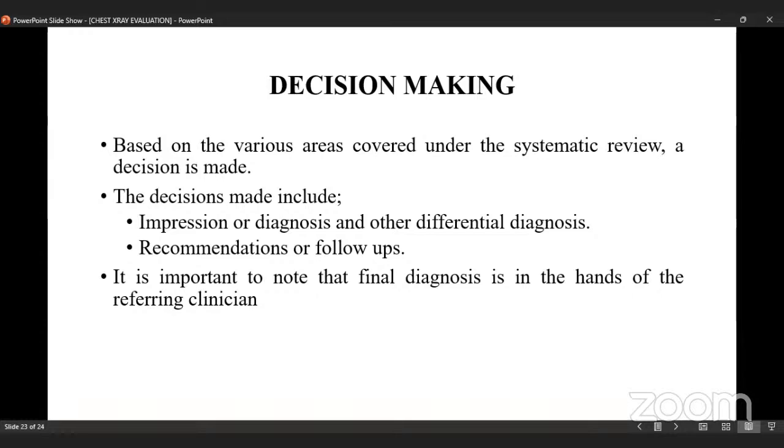You can tell the patient to come on a different day to do a follow-up image. But mind you, the final diagnosis of the radiograph is not in our hands. It is always in the hands of the referring clinician or the radiologist.